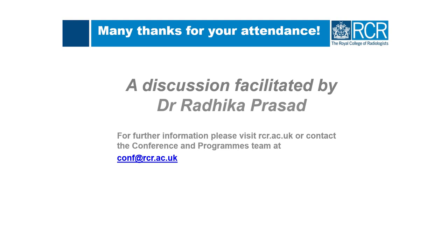Okay. Is that a second question? Best CT settings to detect subtle subdurals? So the hemorrhage windows, I used to use 180/80 when I did my on calls. But everyone has their own preference because it's your eyes after all. But I definitely would have windows for looking for infarcts and windows for looking for hemorrhage.